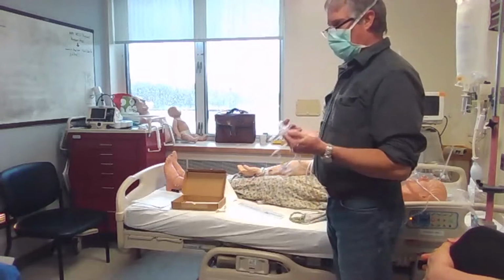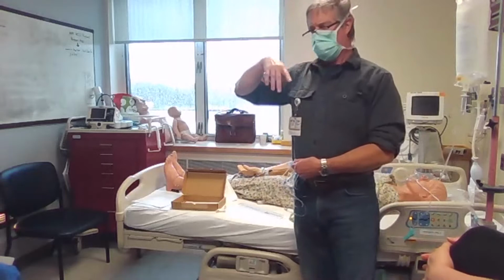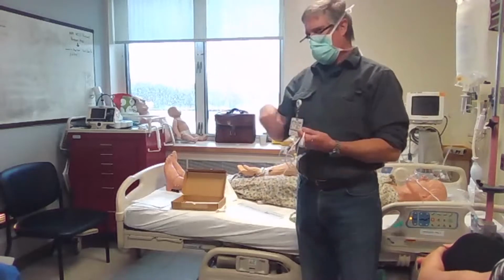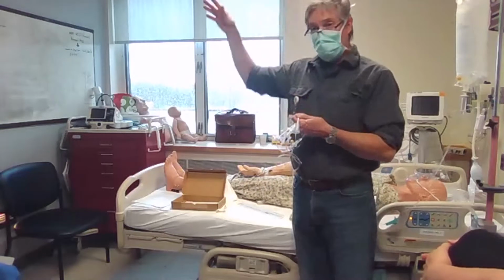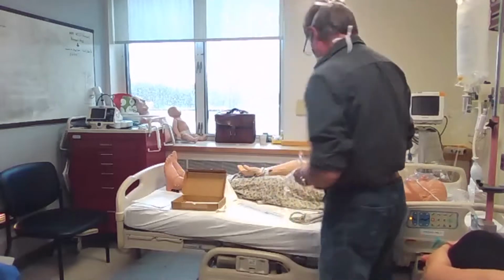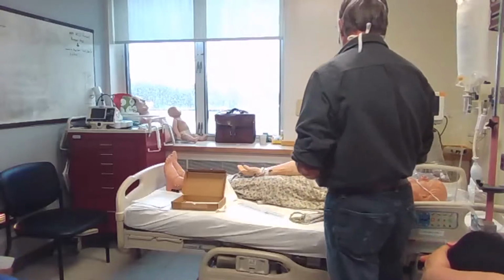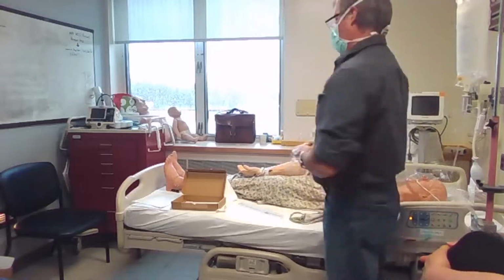So it's not going to give you the right pressure. A lot of times when you look at your waveform that starts, you're going to see a funny looking wave. It's not going to be the whole wave, it might look like half a wave. Part of that is because of this. It might be really, really small, it might be really large. So what you want to do to get an adequate, accurate central pressure from the patient is zero it to the location that you're most concerned about.